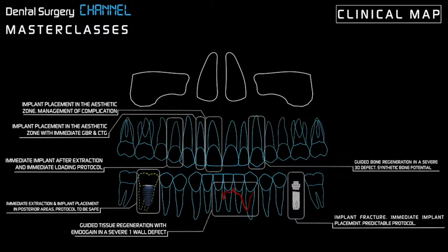We're going to have a guided bone regeneration in a severe 3D defect out of a premolar tooth loss that developed a severe periodontal problem that actually triggered the periodontal problem and contaminated also the periodontal ligament of the adjacent tooth, which was the canine. And how can we, using different biomaterials and different techniques to fix membranes, how can we be predictable?